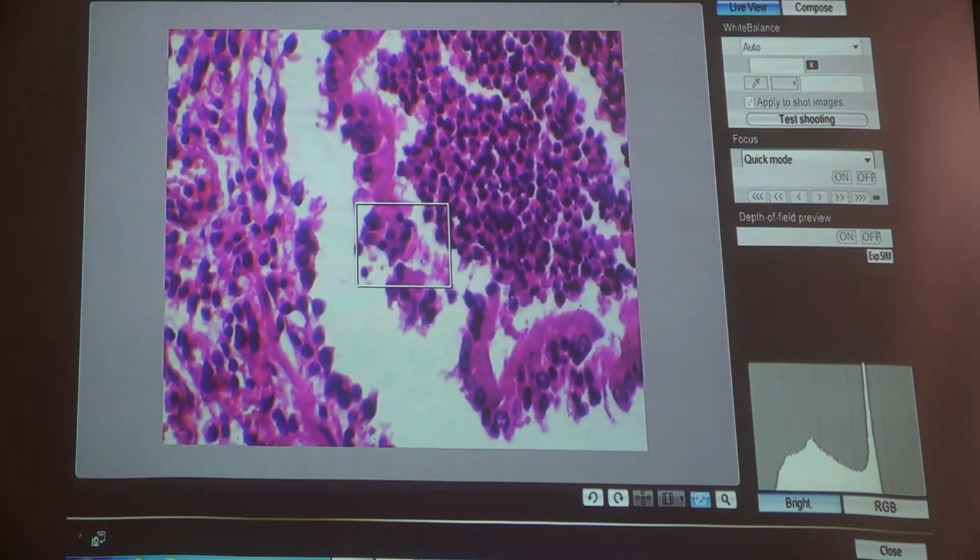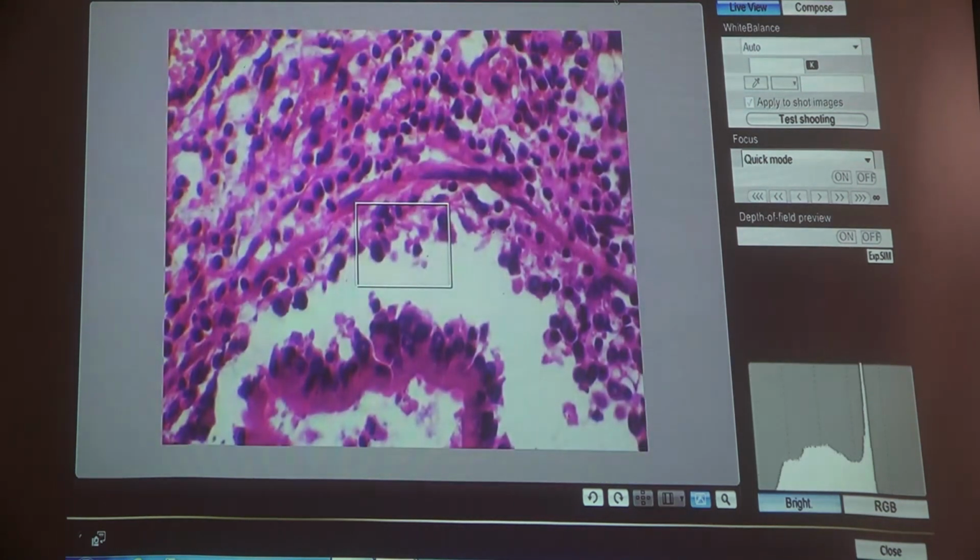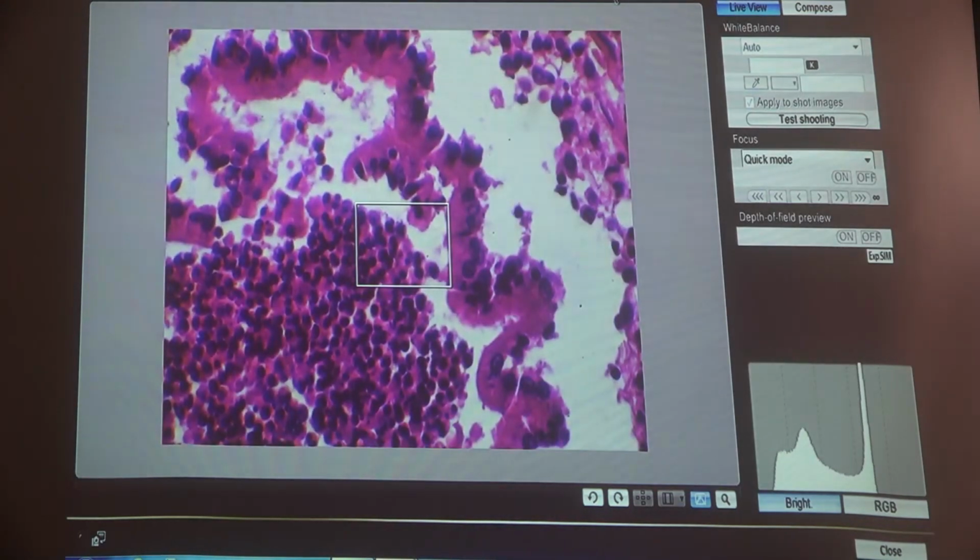This is bronchopneumonia, multifocal acute inflammatory cells infiltration of the alveolar spaces of bronchioles and interstitium. This is bronchopneumonia. The inflammation is mainly around the bronchioles. This is called acute inflammation of the lung tissue.